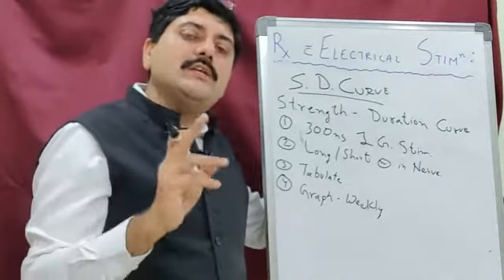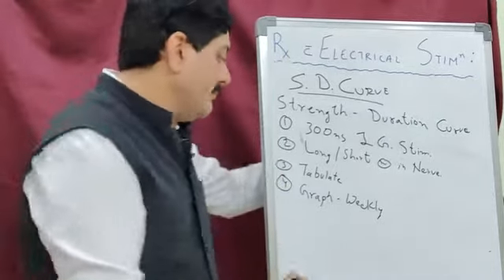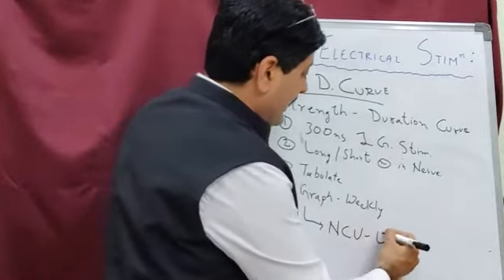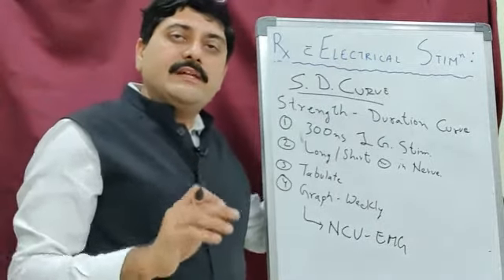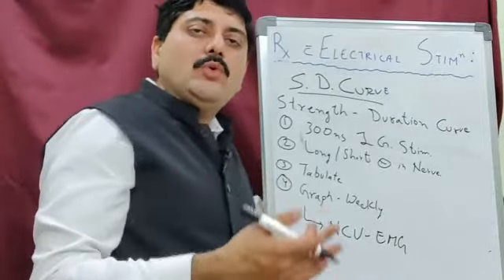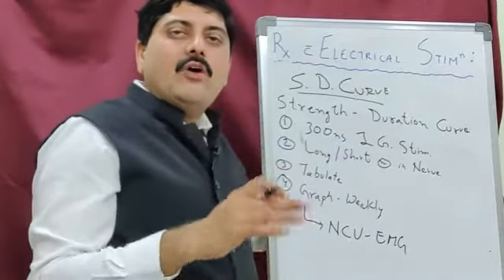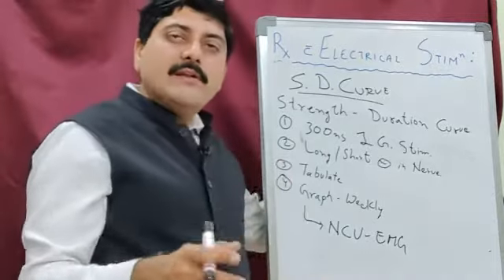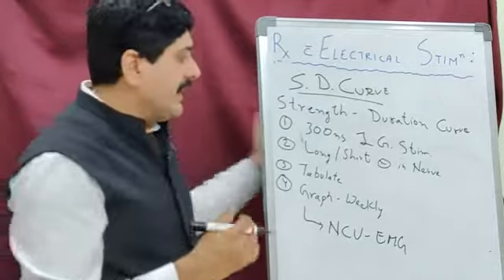If the patient shows improvement, we have to continue with the treatment. If the patient is not showing improvement, then we have to go for further testing, that is NCV and EMG testing, which will be covered as a part of your physical and functional diagnosis, right? So beyond this point, we go to EMG or NCV testing to find out a deeper level or a more qualitative level of performance. So functionally, in our clinics, you can go for this and we can start stimulation on the basis of this criteria.